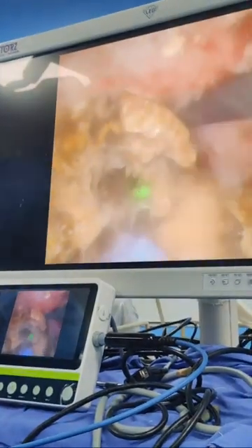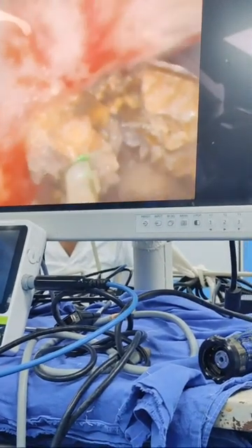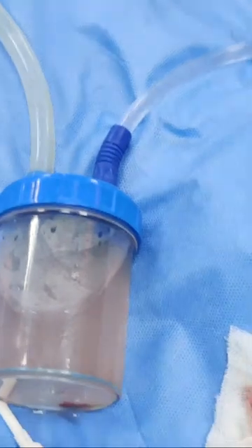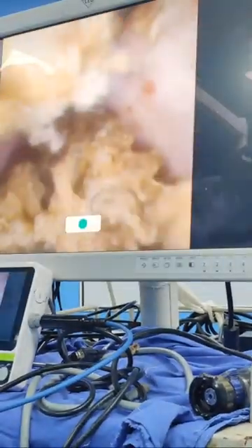So we'll just break the stone once and then we'll. When we take out the nephroscope, we have to see the sheath end. This is the way we just suck out the stone, and the stone goes into the bottle. If you want, we can change the position. Right? Yeah, we'll change it.